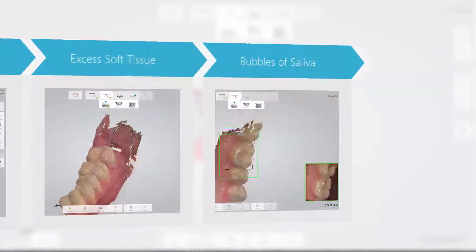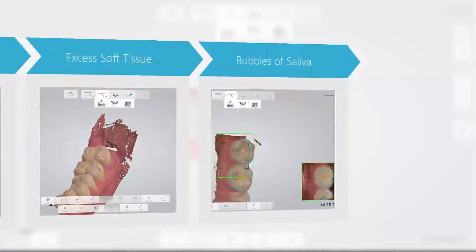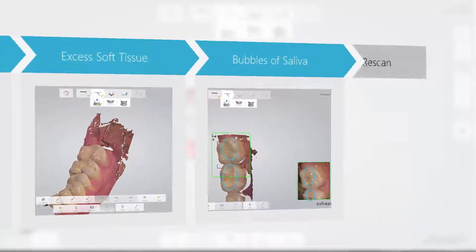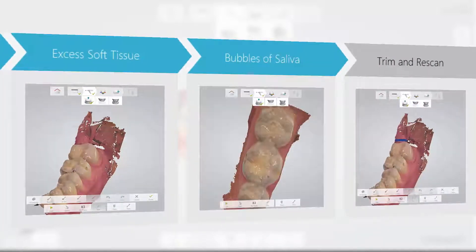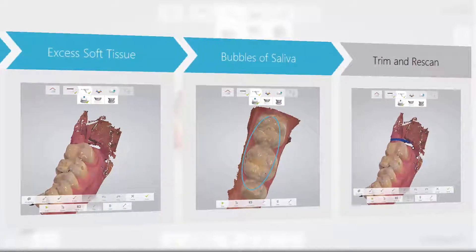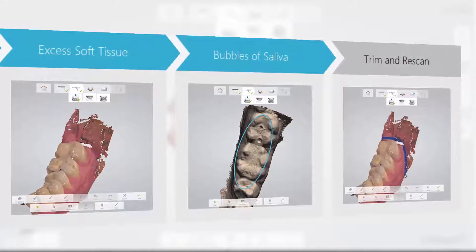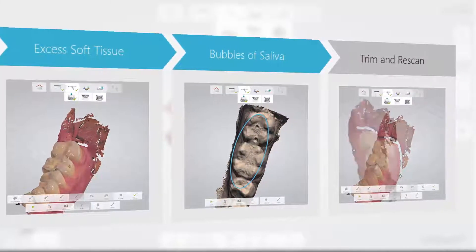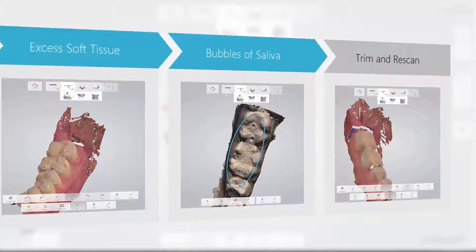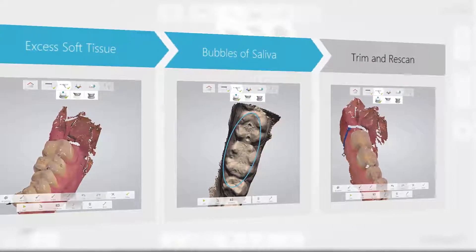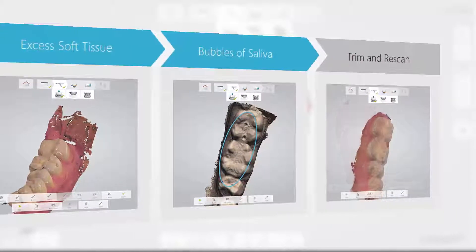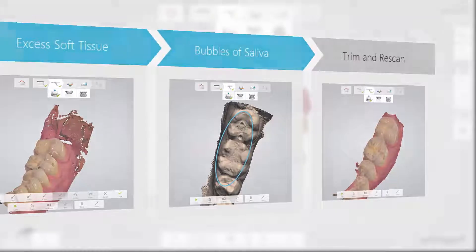Fourth, if you accidentally scan one or more of these artifacts onto the teeth, simply trim away the artifact and re-scan that area.